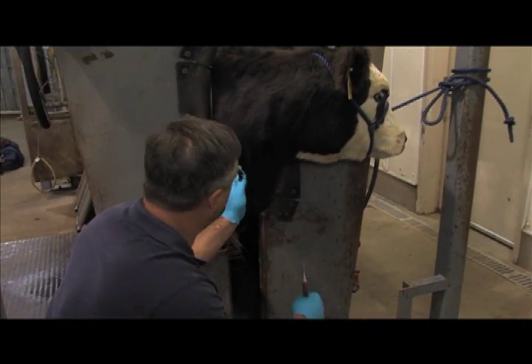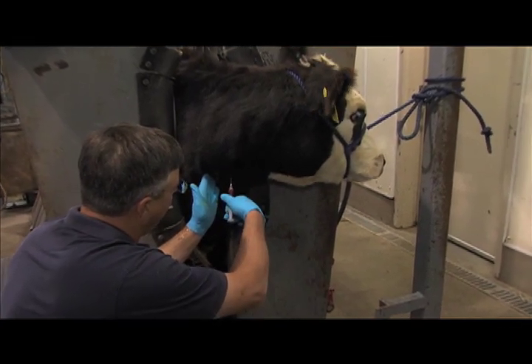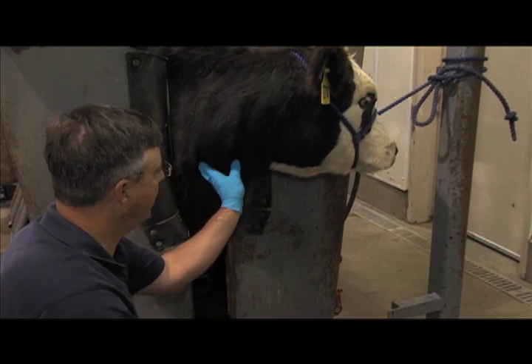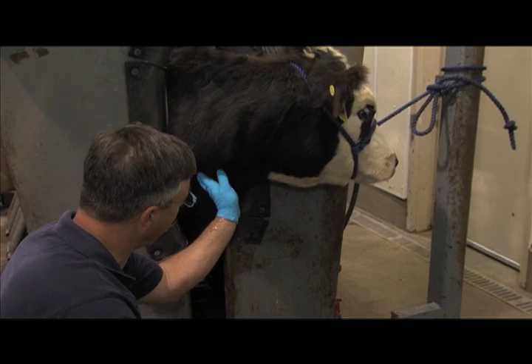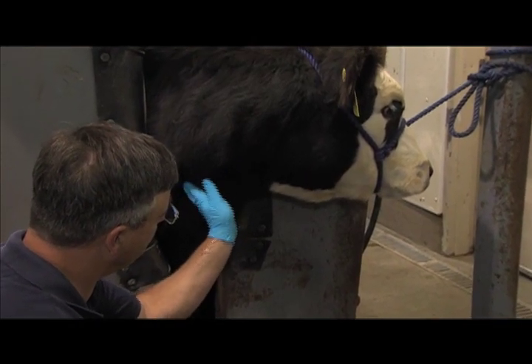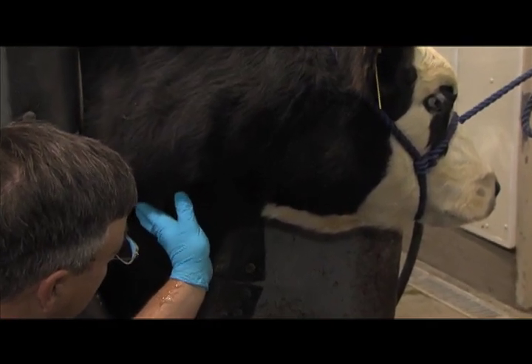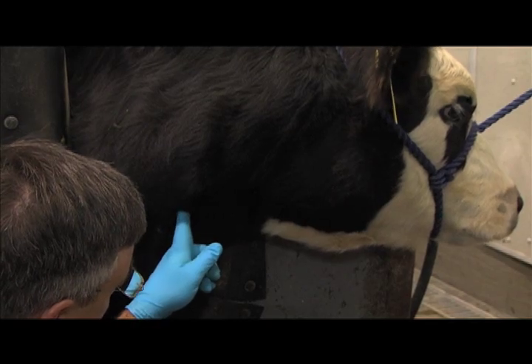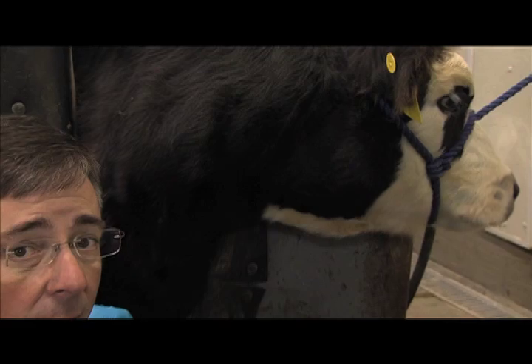Typically, the best sample is taken when, again, the needle is inserted perpendicular and directly on top of the jugular vein. You can see the jugular vein right here. My thumb is on top of it. I don't know if you can see it rise and fall as I clamp it off there. But again, you want to go perpendicular and pop it right through, draw back, draw your sample, and off we go.